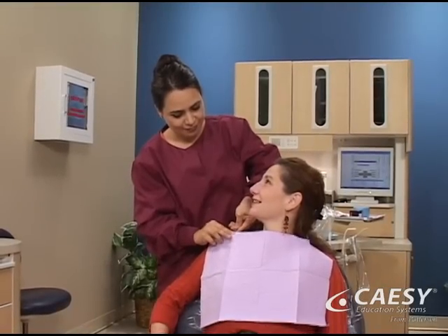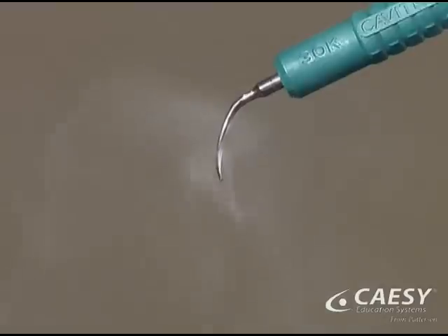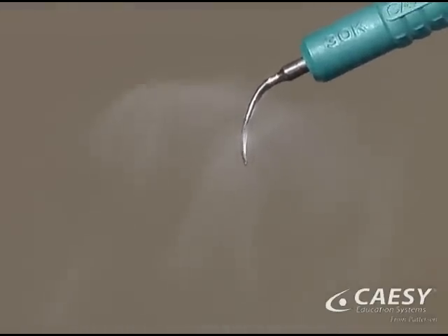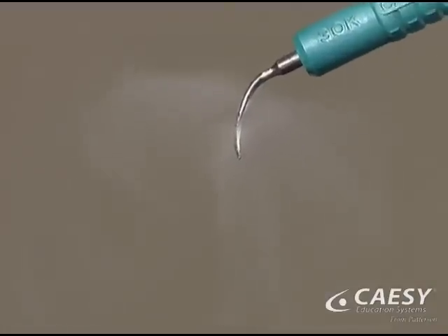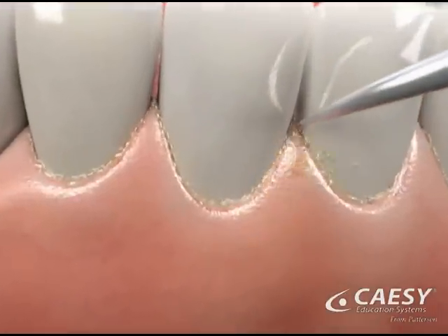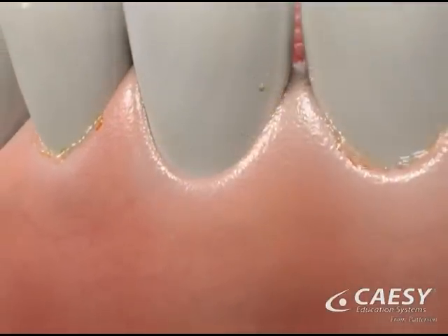Ultrasonic scaling is one of the most effective procedures for removing plaque and tartar. An ultrasonic scaler consists of a wand with a small scaling tip that produces a soft vibration and a gentle flow of water. As the tip moves along the tooth surface, it makes quick, small vibrations which break up the plaque and tartar.